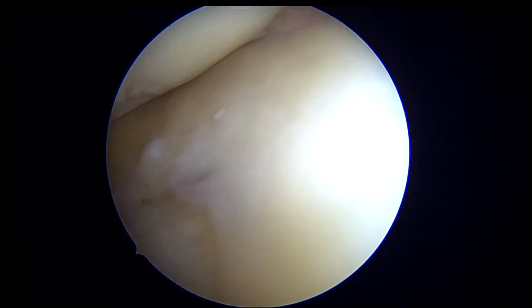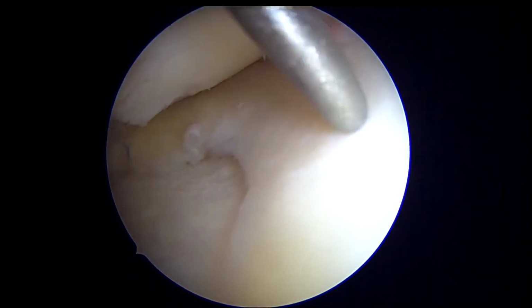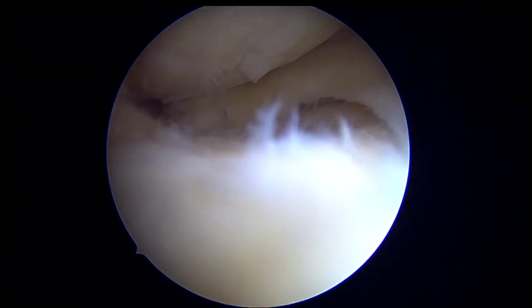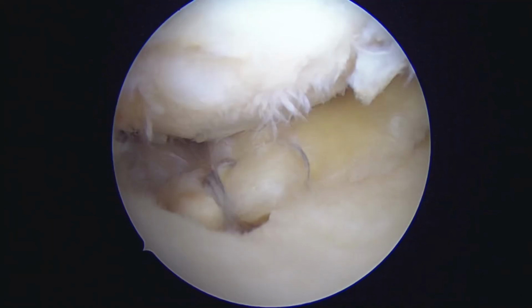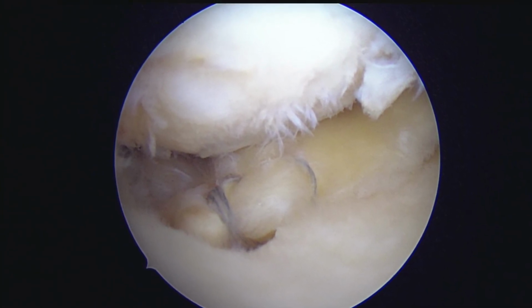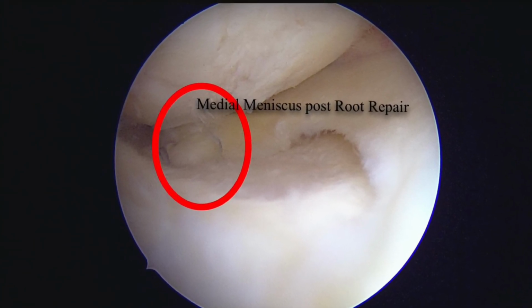So we pull all the wires, the suture tape of both the knots, through the tunnel, and here you can see the reduction of the meniscus. The meniscus has already fallen back in between the condyles, and it is covering a good part of the tibia now. This will go a long way in preventing the further cartilage degeneration of the patient. This is how it looks finally after the surgery.